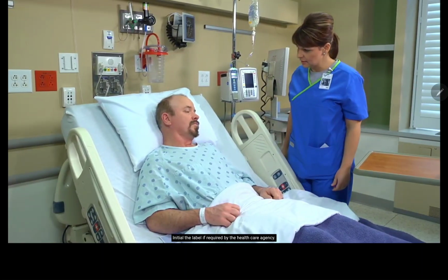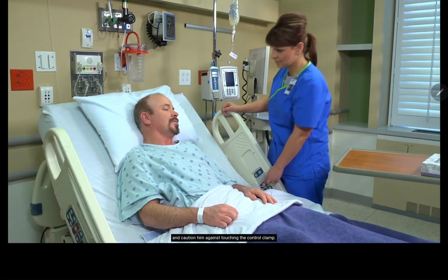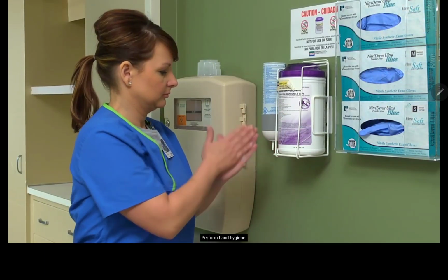Can I get you anything else right now? No. Okay. Instruct the patient to avoid raising his arm, since doing so may affect the flow rate, and caution him against touching the control clamp. Perform hand hygiene.